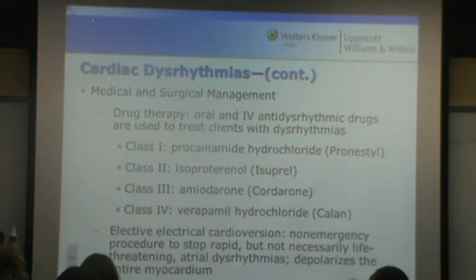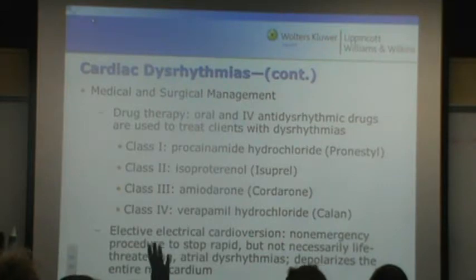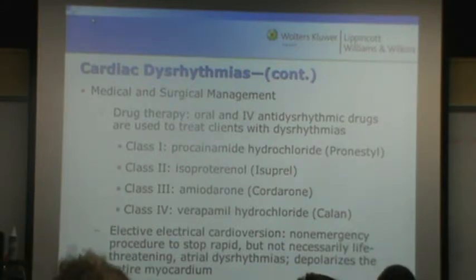So defibrillation is not timed. With defibrillation, we're shocking rhythms like V-fib and pulseless V-tach. If they have a rhythm that has a pulse, whether it's SVT or atrial fib with RVR or V-tach with a pulse, we have to use synchronized cardioversion. But unfortunately, like I said, it depolarizes the entire heart.